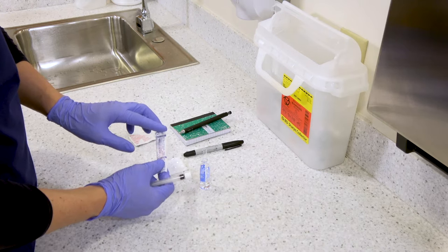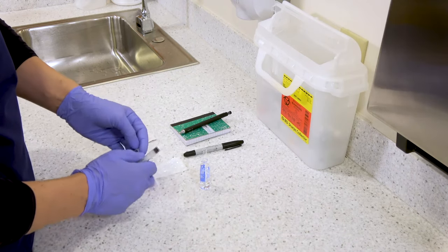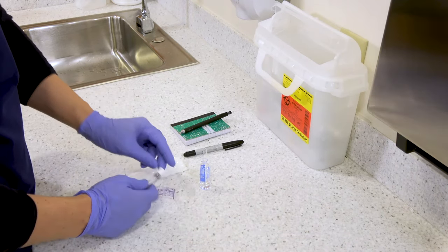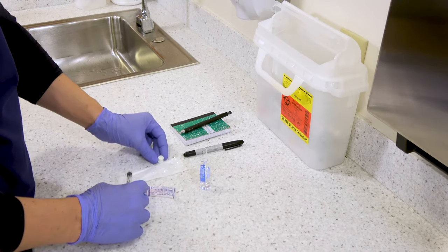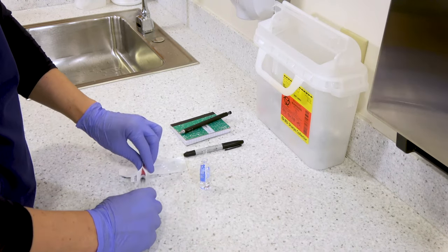Grab your three milliliter syringe, and this time instead of a blunt tip needle like you would for a vial, you need to attach a filter needle. This is how we're going to prevent getting glass into the syringe and then into the patient.